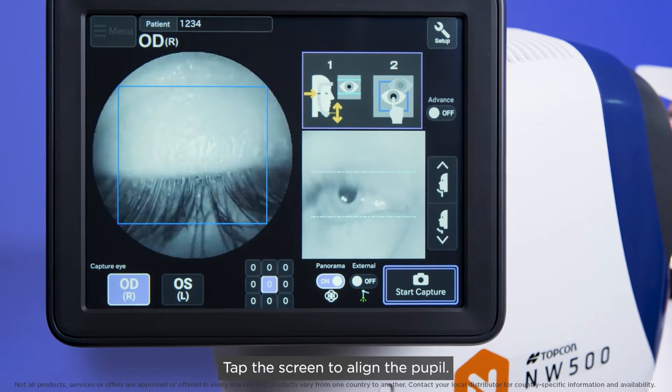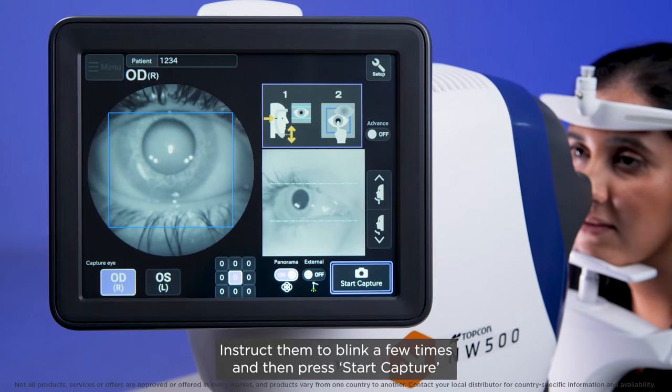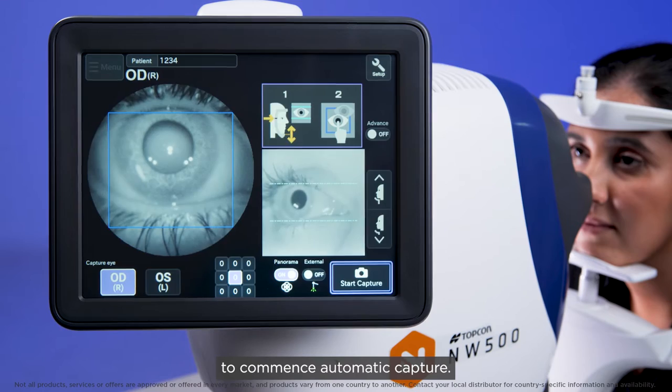Tap the screen to align the pupil. The patient will follow the fixation target. Instruct them to blink a few times and then press start capture to commence automatic capture.